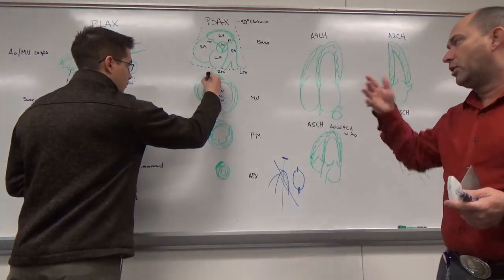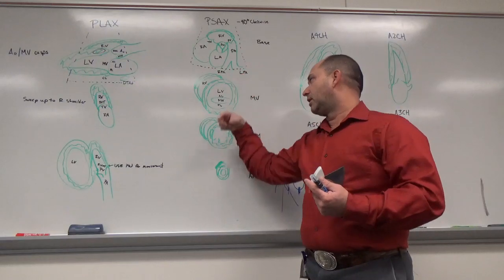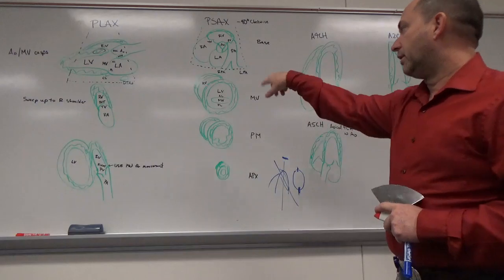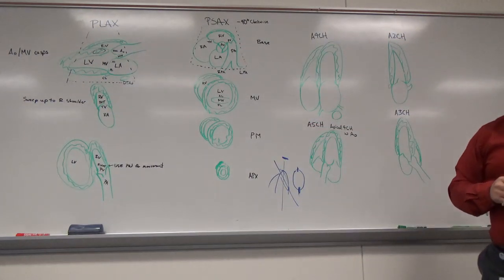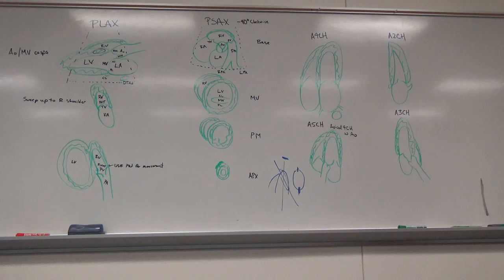If I'm going through the heart in a 3D perspective, we'll say our apex is out here, the atria are on that side of the board. If I'm looking to go out the aorta, where do you think the flow is going to go from that perspective? This is sort of an indirect assessment. But where on this image would the LVOT be, for example? The atria are on the other side of the board, apex is out here. So where would the LVOT be more directed towards?